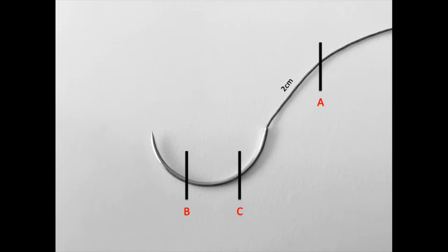Lastly, point C, a point one-third from the hub, will be where our needle driver grasps.